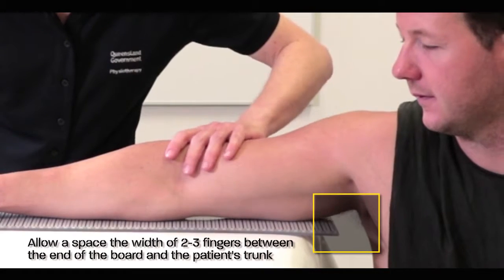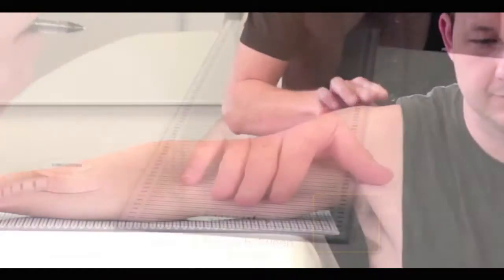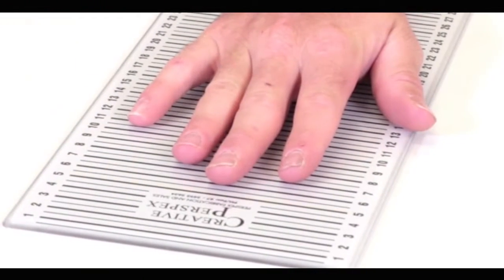Allow a space, the width of two to three fingers between the end of the board and the patient's trunk. Note the level of the tip of the third finger on the board and note this on the arm measurement form.